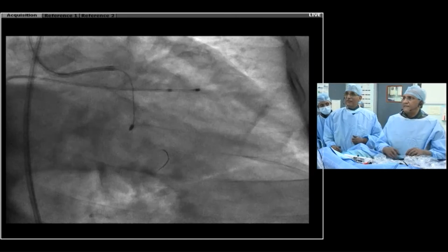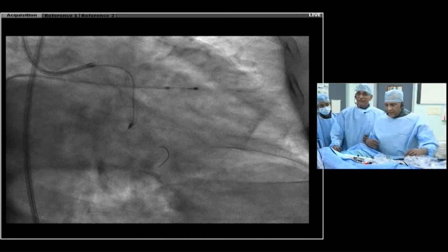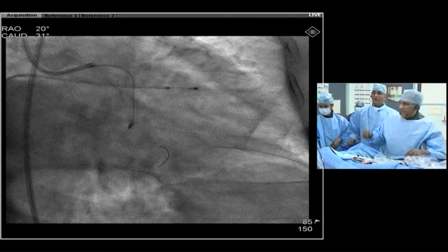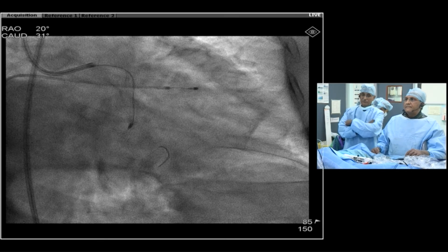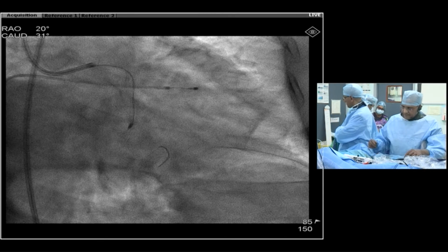I will. Stop. Be careful, because you could have problems. Give me a cut, give me a Guidezilla. Take Kirti, second wire, take a small balloon, and then make a further rotation.